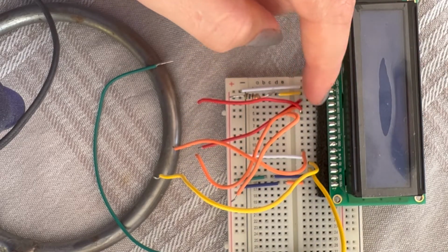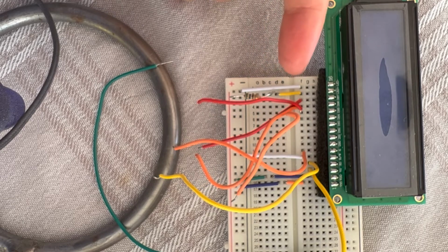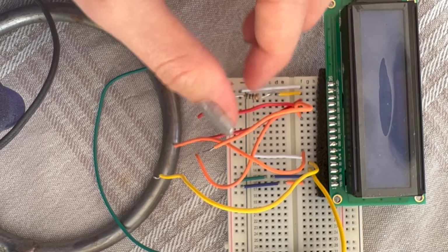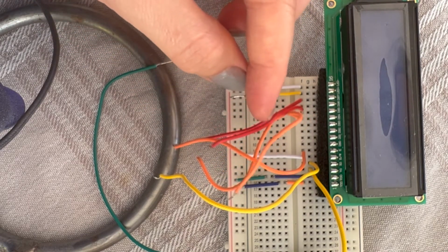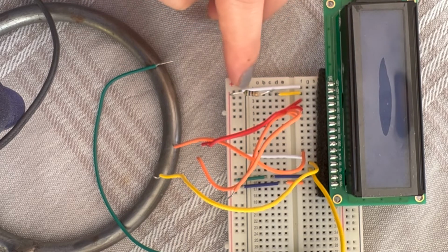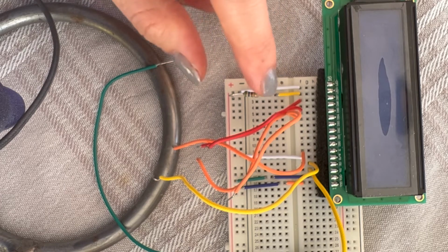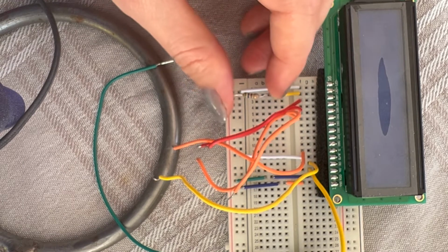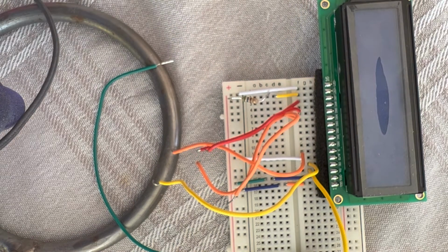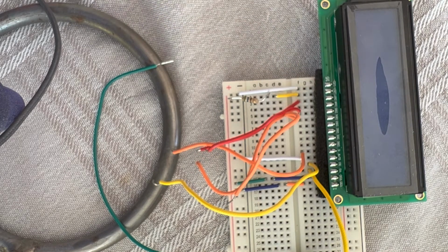So these are D4 to D7. They will be connected to 2, 3, 4, 5, but in the opposite direction, so this one goes to 5, and the other one, which is red, goes to 4, and 3 and 2. The two last ones are for the LED. The LED negative is the ground, and then LED plus is the second one. You don't have to use a resistor, but it's better to use it to be safe. This resistor is 4K, 4000 ohm. You just connect it to the LED plus.